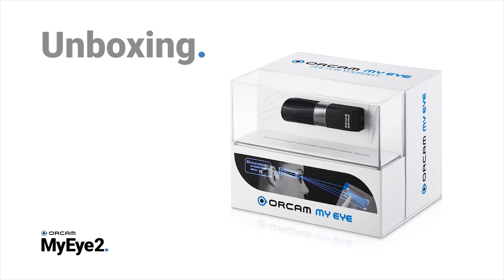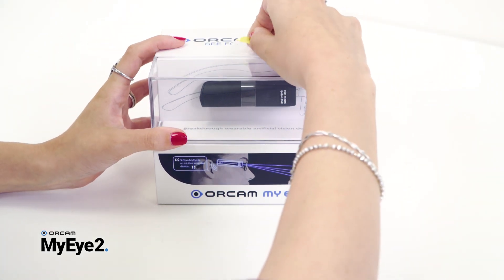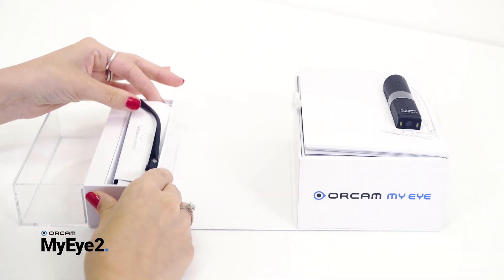Congratulations on receiving your new OrCam MyEye 2.0 device. Please open the box by pulling on the yellow tab next to the plastic window. The box opens like a book. The upper side contains the pre-mounted glasses frame, which you can pull out.